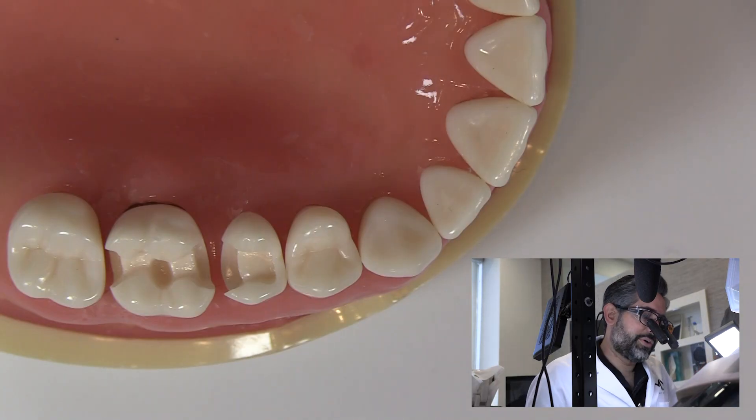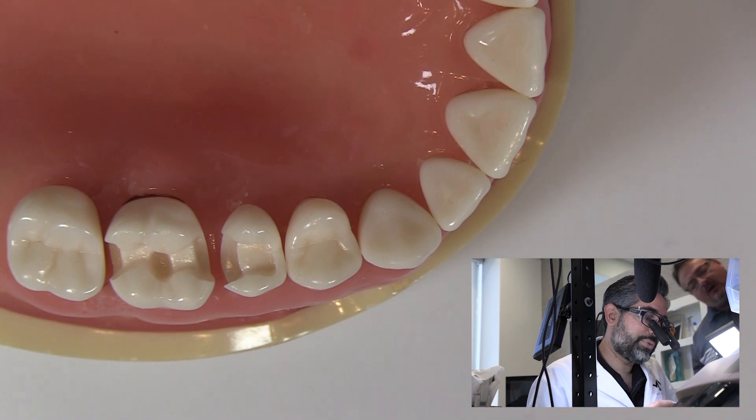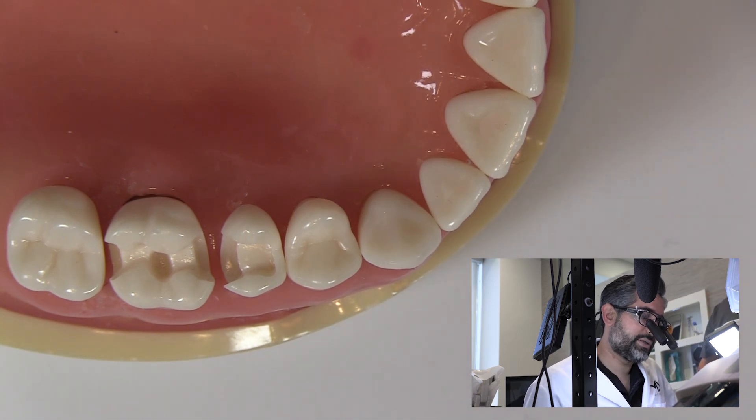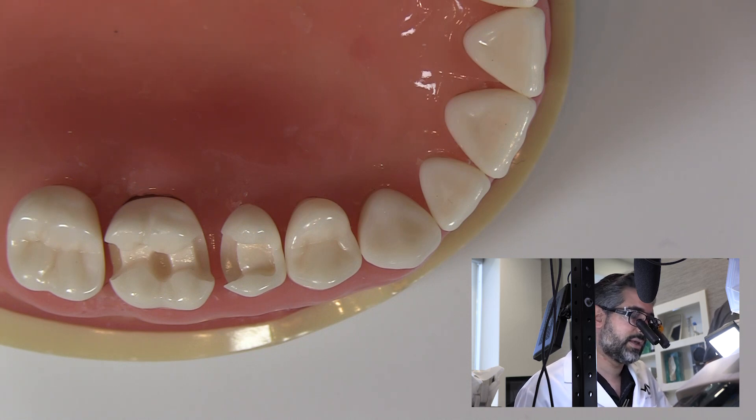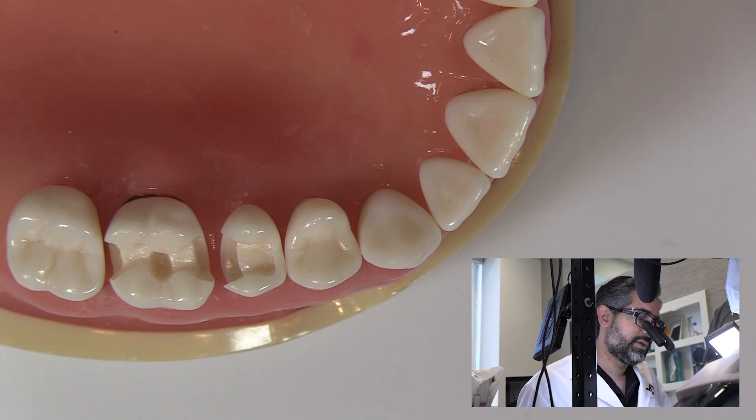Taking a look at this configuration here, I'm pretty simple when it comes to these things. I like to do one tooth at a time — there are a lot of advantages. I like to make sure I can finish the proximal margin with a 12 blade. There's no reason to eliminate that possibility when we have open access. I like to be able to contour the proximal surface a little if I need to after I'm done, and when you do one at a time, you have that benefit.